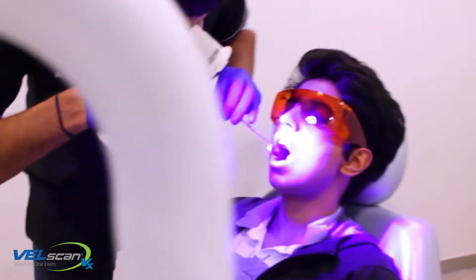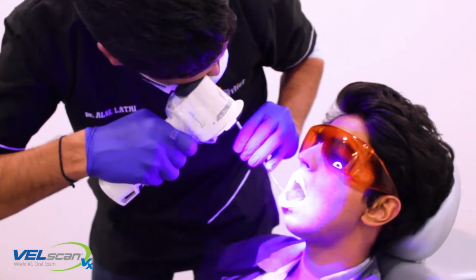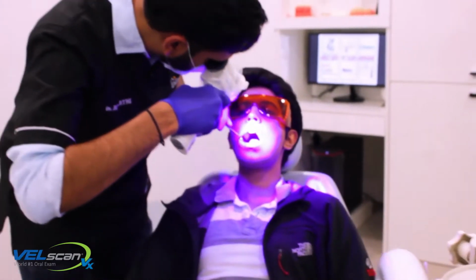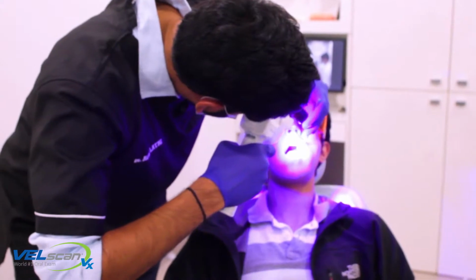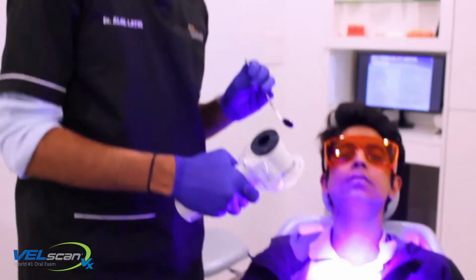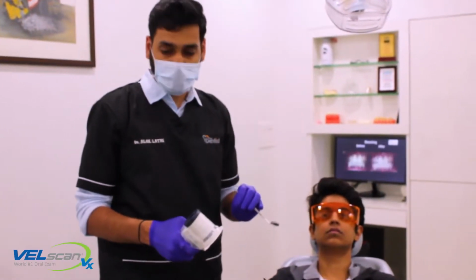So the blue light actually enters the upper cells of the epithelium, reaches the connective tissue and passes back. If there is no reflection coming out, as in this case, of any areas, the labial mucosa, the buccal mucosa, the tongue, the hard palate, the soft palate, the ventral surface of the tongue, at that point of time, a suspicious lesion is developing in the oral cavity, and this is how the white light and the blue light combination is mandatory for every patient.